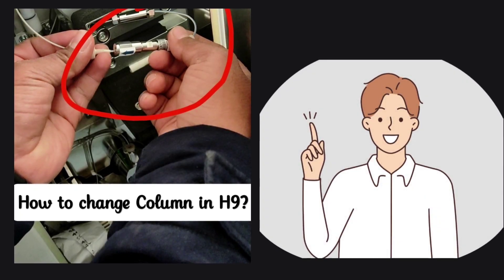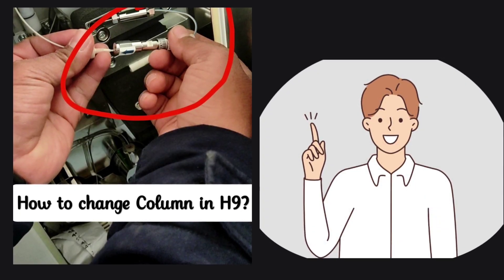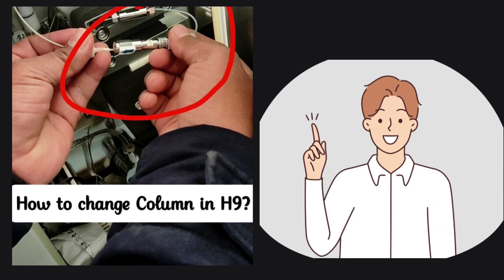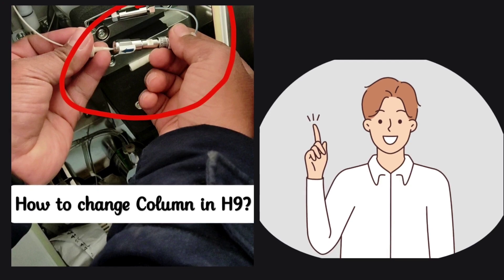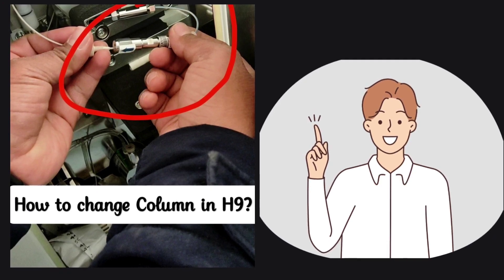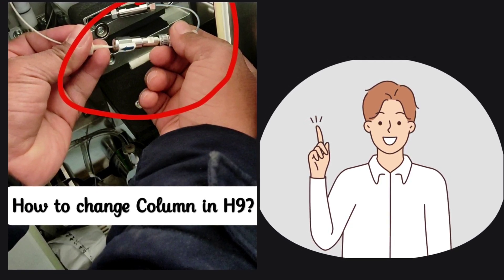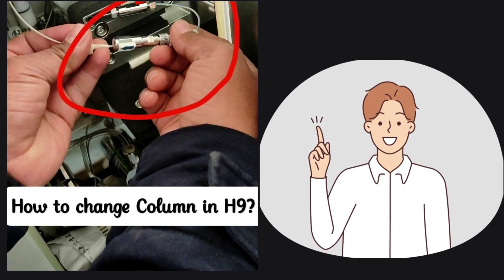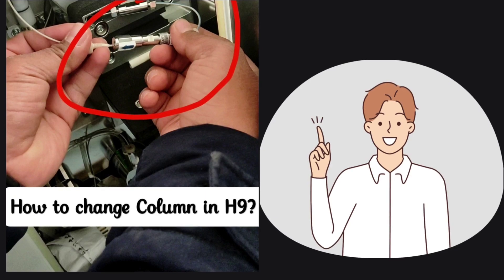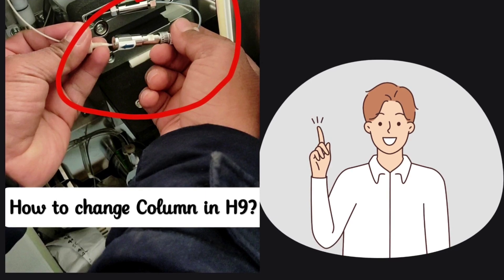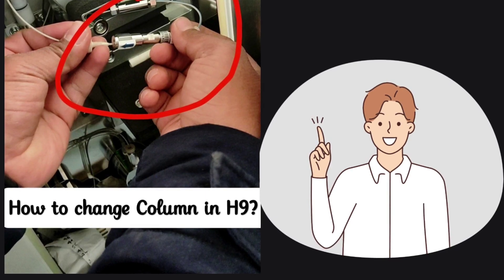Welcome you all. Here we are going to learn how we change the column in NH9, as this might help medical technologists when the test count is exceeded beyond 16,000.